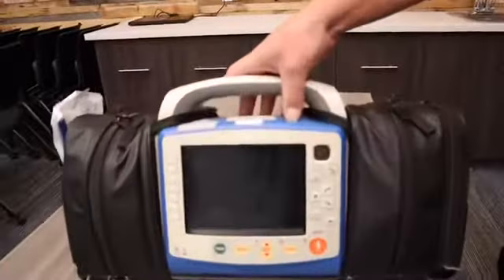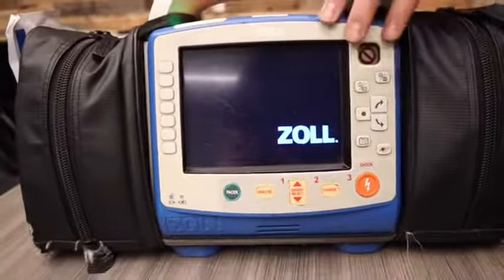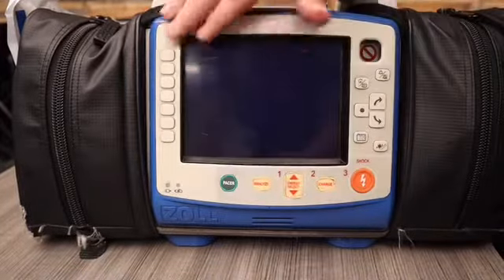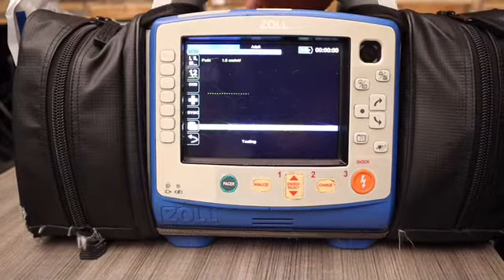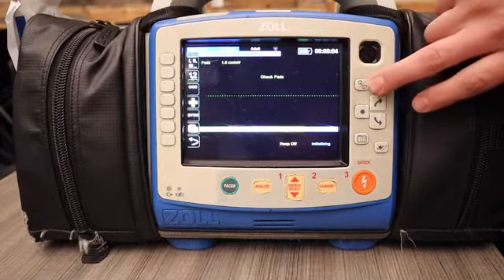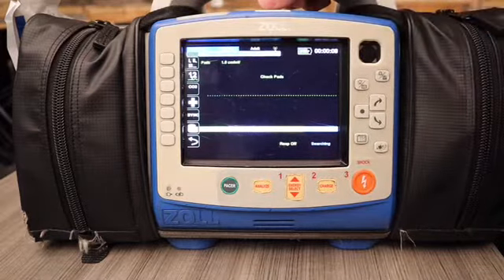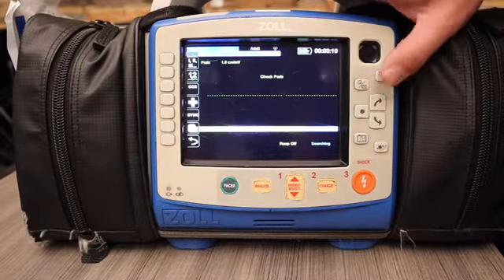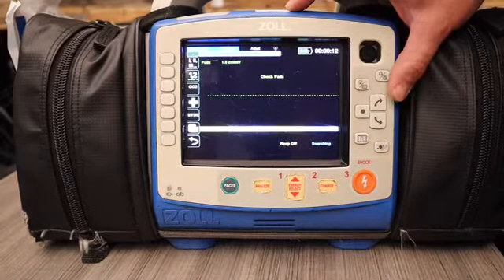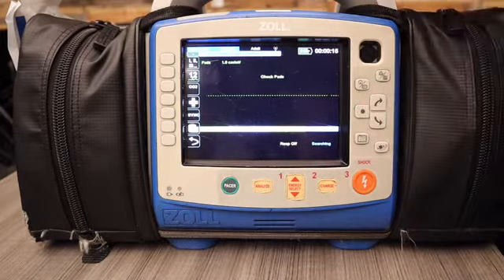Here on the monitor when you power on, you'll notice there are tons of fixed buttons. This button right here is your home button — that's going to default you back to this screen wherever you're at. This button up here silences your alarms, and this is how you scroll through your settings with the enter button.